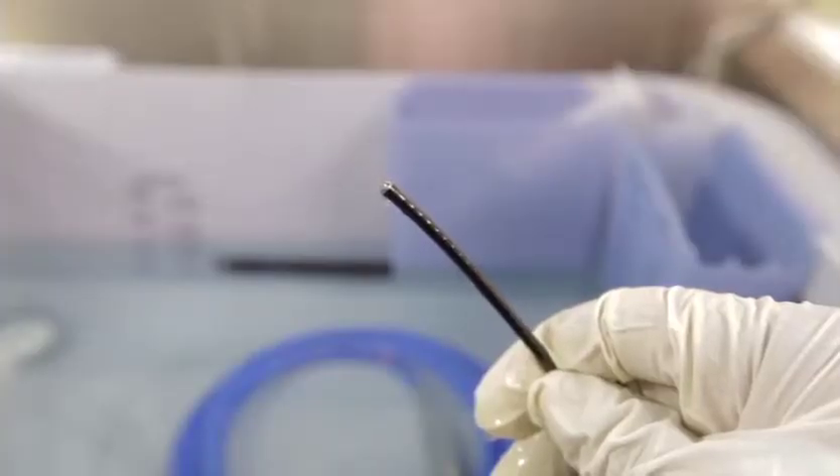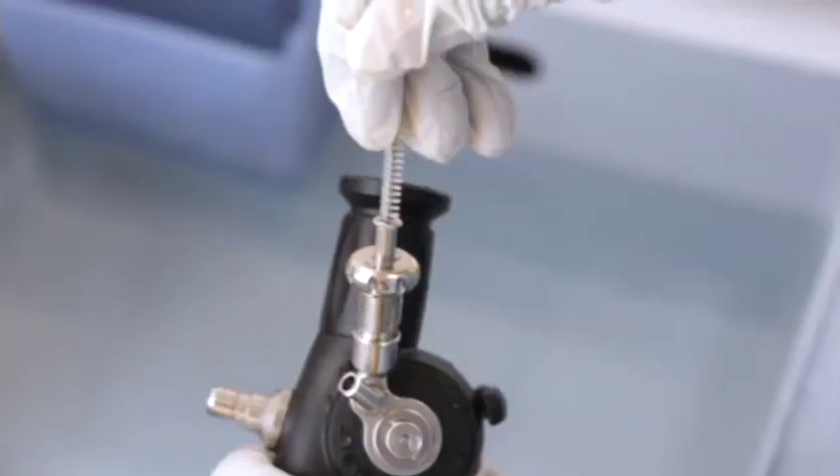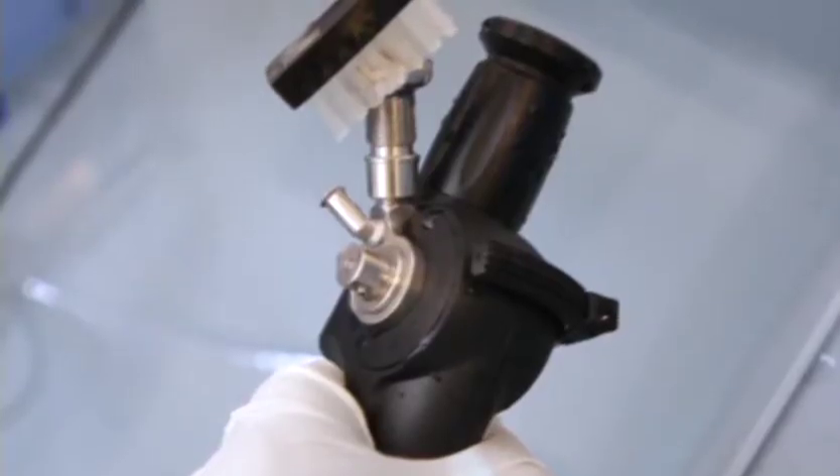You are now ready to clean the ports. Clean the ports by advancing a short cleaning brush until there is resistance at the bend of the port, then rotate the brush to clean the walls of the port.